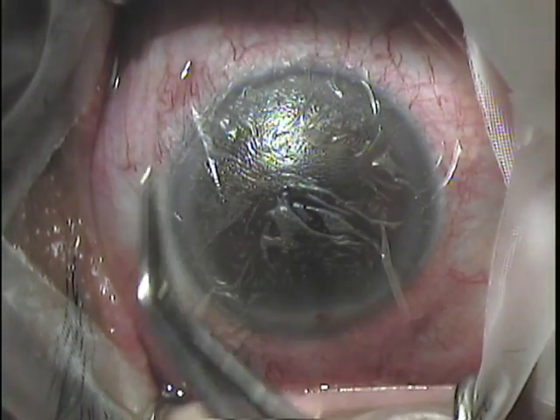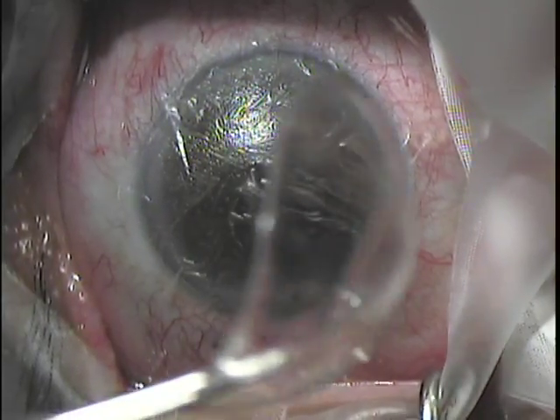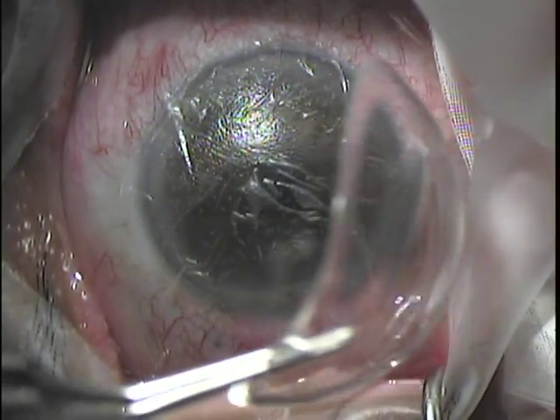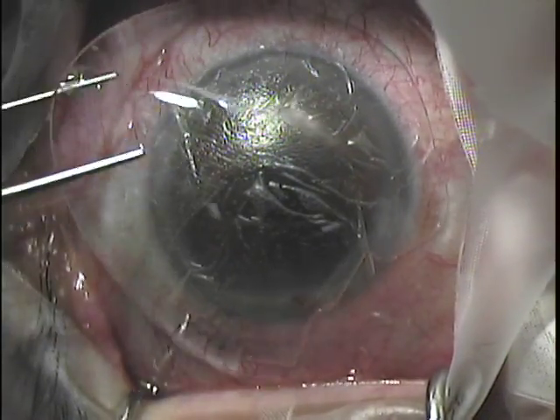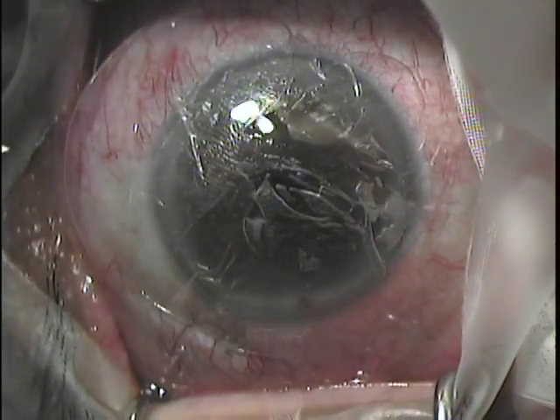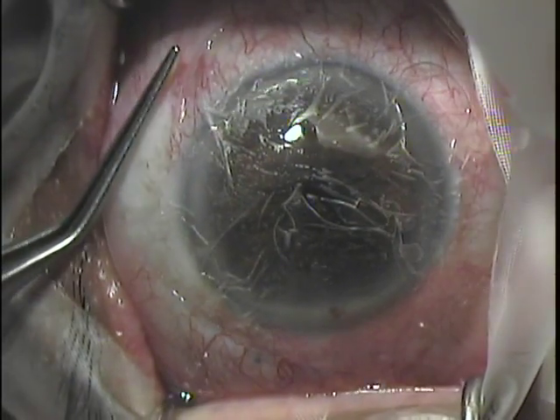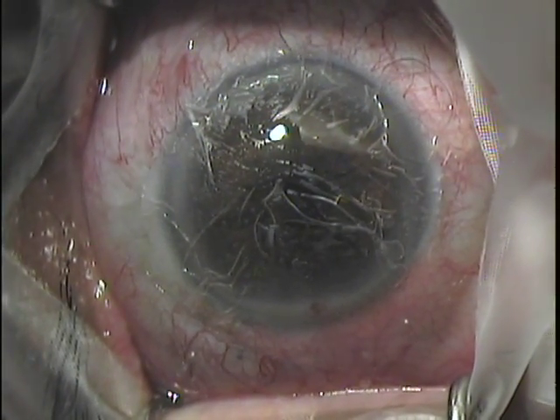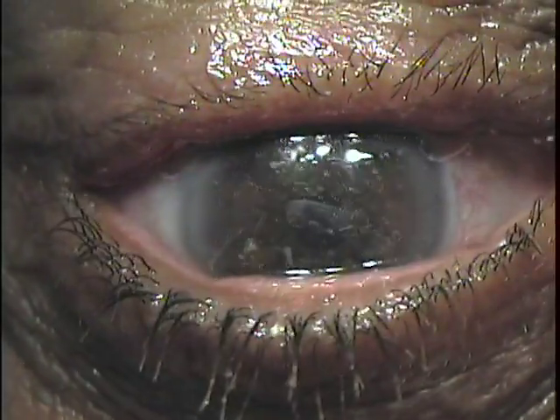The last step is to take a contour contact lens using non-toothed forceps and place it down onto the amnion without sliding it around, so there are minimal tractional forces that would potentially dislodge the amnion. The stria and air bubbles that you'll see under the amniotic membrane will fairly quickly disappear.